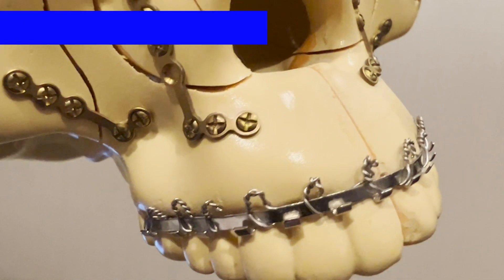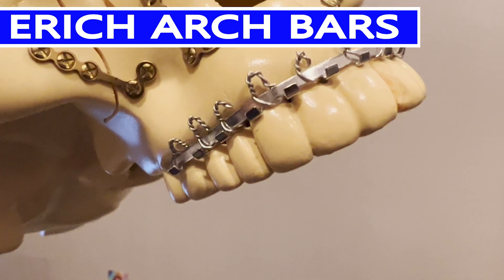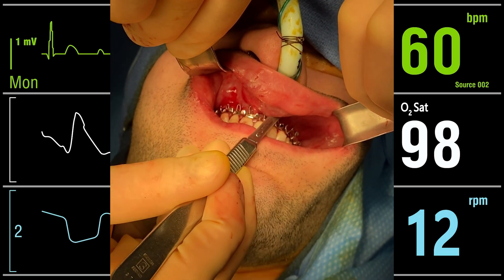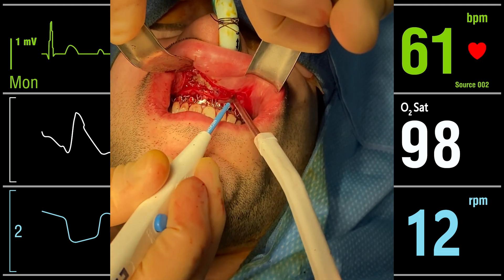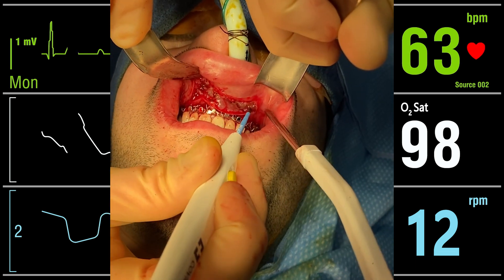This procedure is done in the operating room under general anesthesia using a nasal intubation. Since this patient is in Invisalign, I placed arch bars to aid in the surgery and in the post-operative treatment. Once the patient was prepped and draped, I made a mucosal incision from first bicuspid to first bicuspid.